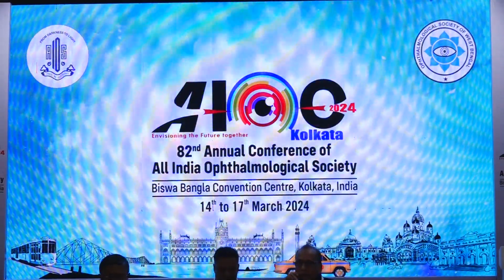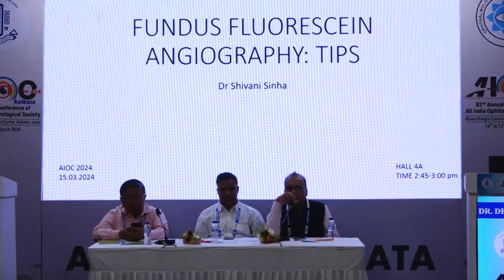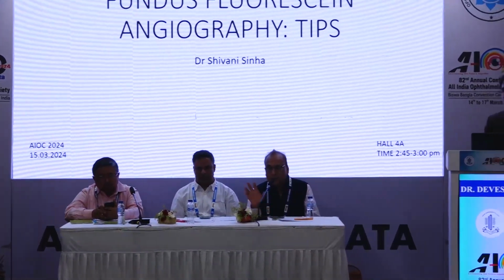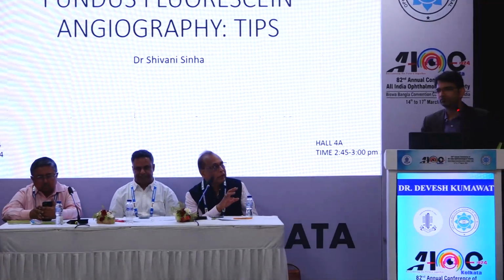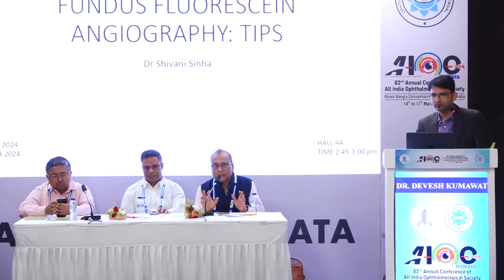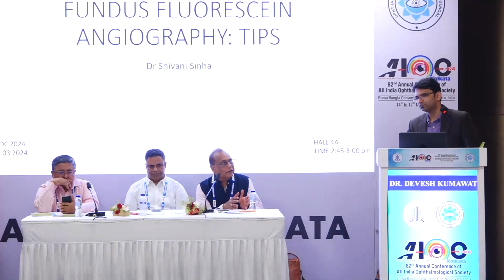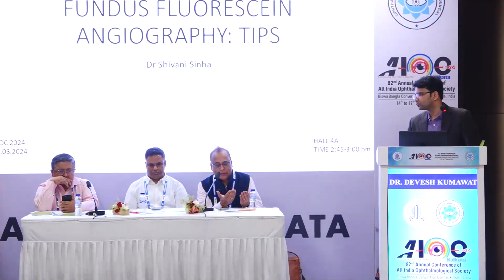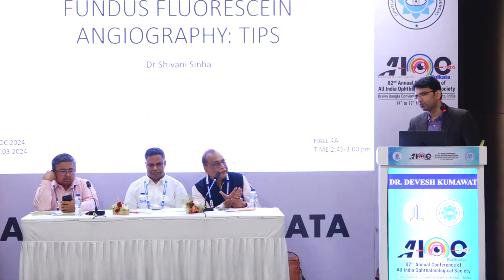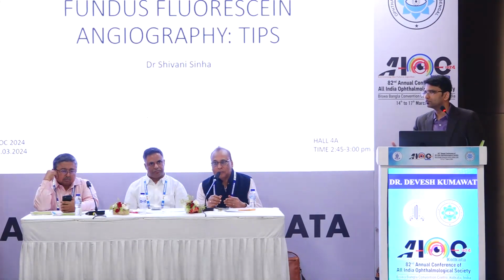Right. Just one point, especially on the glaucoma module. Deciphering the defect in the glaucoma module, especially the RNFL defect, is all color coded, and you get a graphic representation as well. From those you can make out, whether it is green, yellow or red, whether there is a defect or not. So by simply looking at the color coded map, one can make out whether there is a deficit in the RNFL or not. Same goes for the macular thickness.